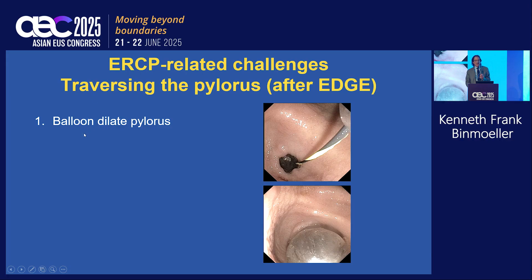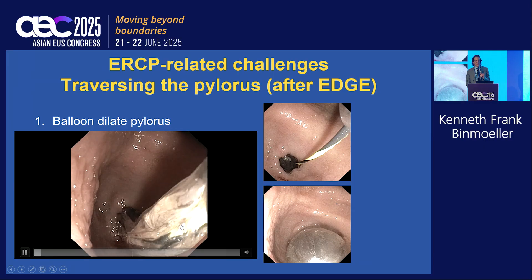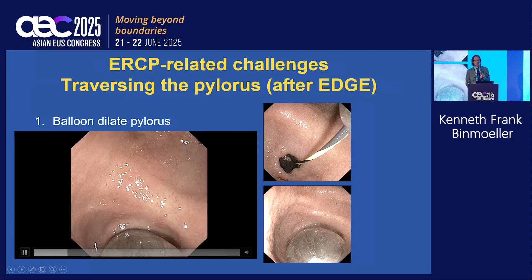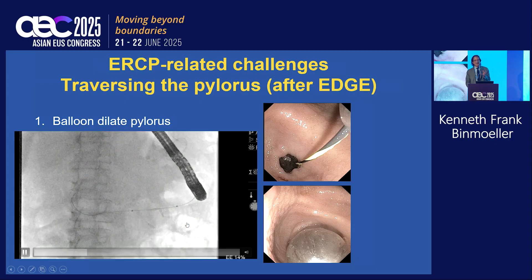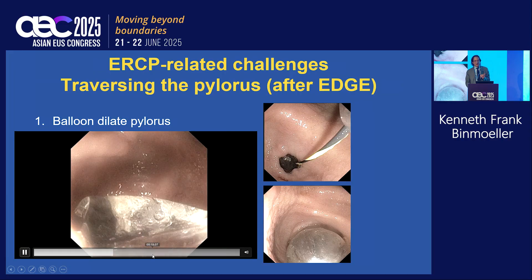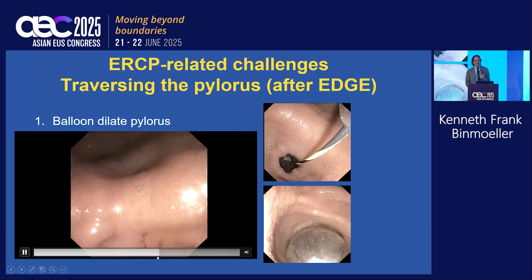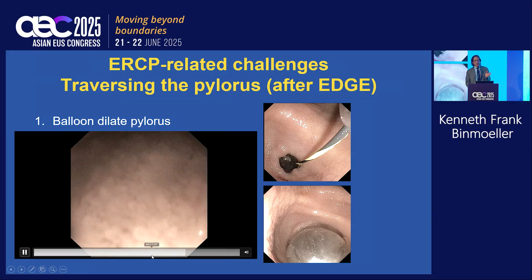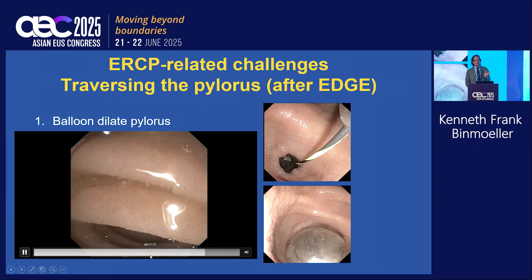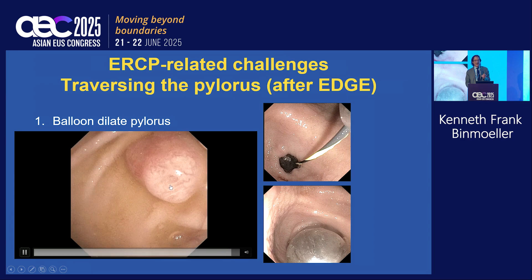After an EDGE procedure, traversing the pylorus can be challenging, especially if you placed your LAMS too distal. What usually works is to dilate the pylorus with a balloon catheter — we use the largest, a 20-millimeter balloon. You can see in this video inflating the balloon. After dilating the pylorus, you can attempt to pass your duodenoscope across. Never push excessively against resistance. With the duodenoscope, we can pass into the bulb and then onwards into the second duodenum, and here you see the papilla.